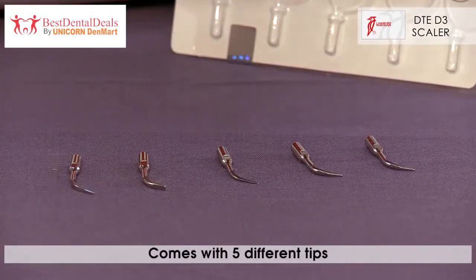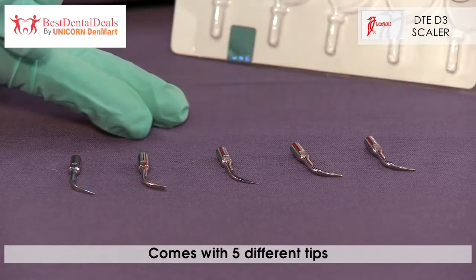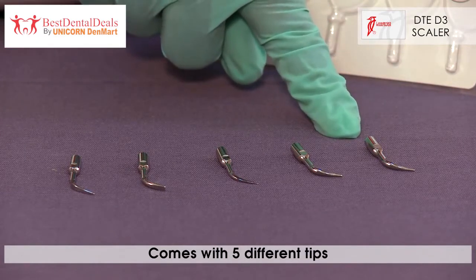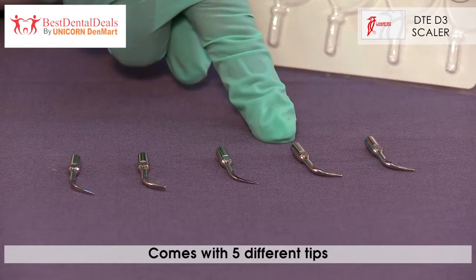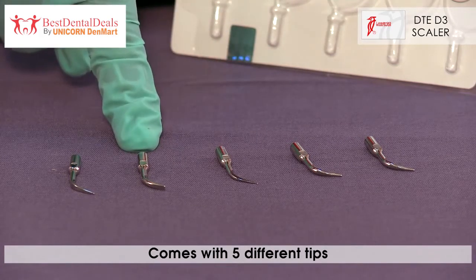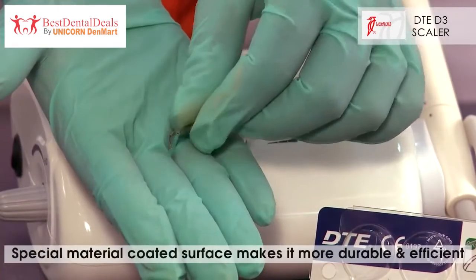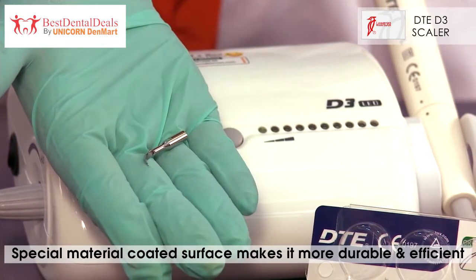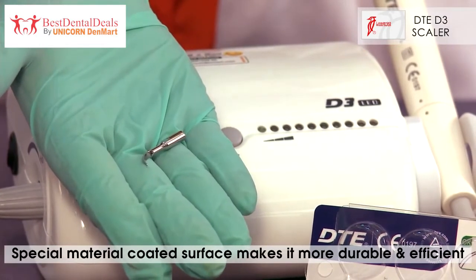The Woodpecker DTE-D3 Scaler comes with five different tips: two tips for perio procedures, one for stain removal, and two for scaling. The tip surfaces are coated with a special material, making them more durable and more efficient.